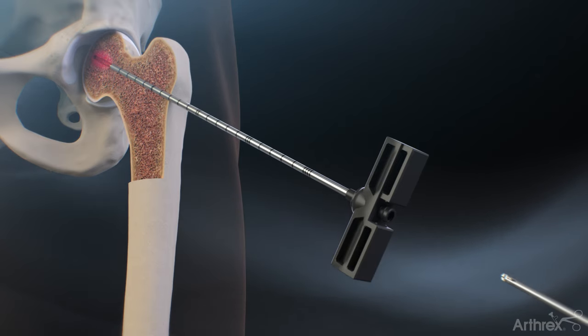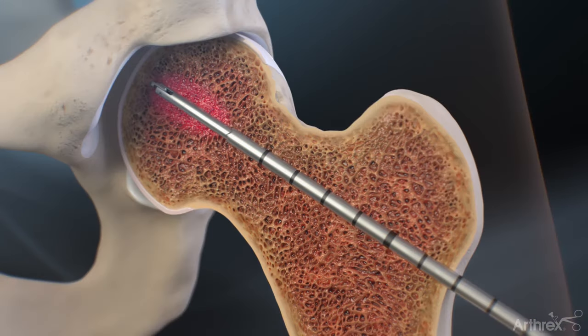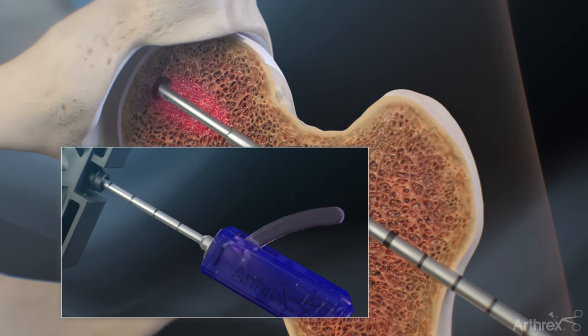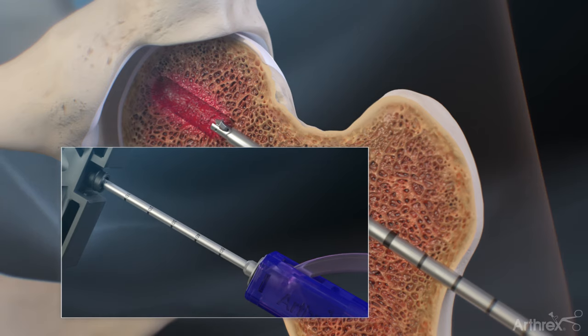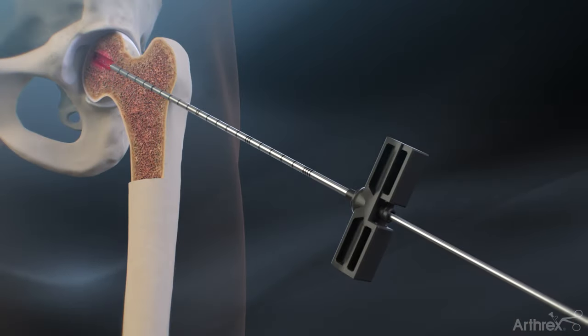The IOBP decompression device is then advanced through the delivery cannula and to the depth of the desired decompression. Once drilling is initiated, the trigger mechanism is then engaged to flip the cutting feature. The 7 mm decompression device is then pulled back to achieve the desired length of decompression. The trigger is then released and the device is withdrawn.